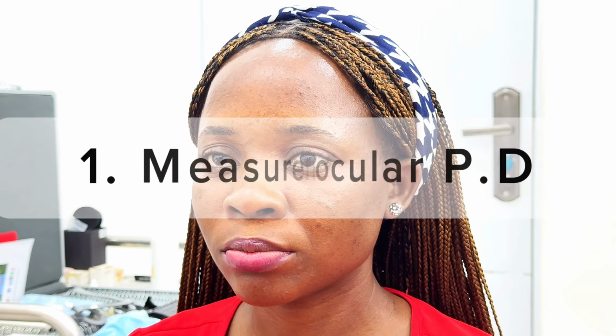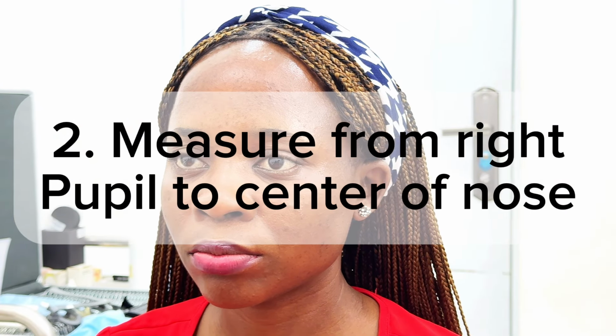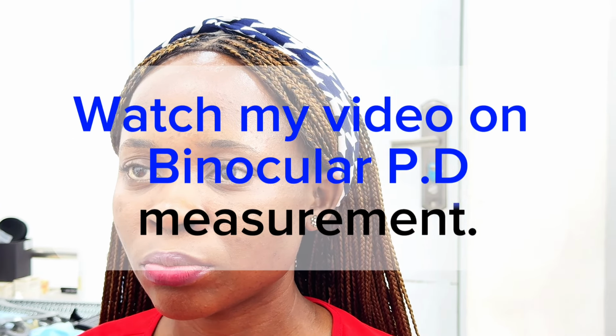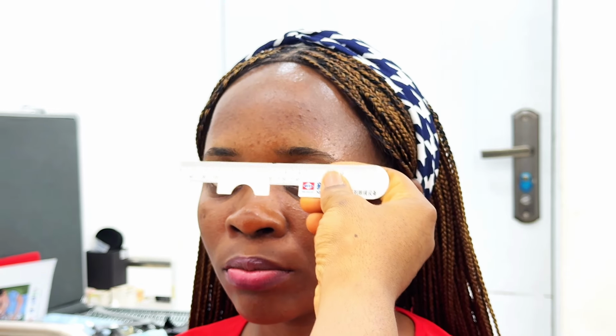So the next method of measuring the monocular PD without the glasses is simple. You measure your binocular PD first. Secondly, you measure the distance from the center of your patient's right pupil to the center of her nose bridge. So you know how to measure the binocular PD already. If you haven't watched that video, you can watch the video where I taught you how to measure the binocular PD. So let's measure the right monocular PD.